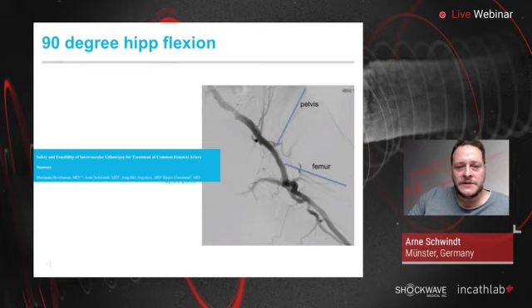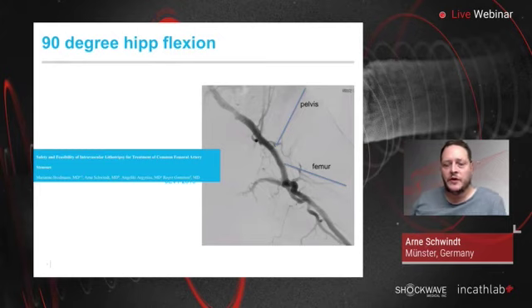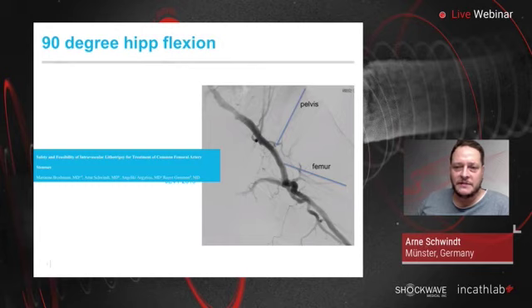And what I always think as a surgeon, you know, these therapies are not competitive, they are sequential. So if this stent at any time gets a bigger problem, I can go back surgically or endovascular at any time. So this is something we can discuss. Is there room for this therapy in other vascular beds?